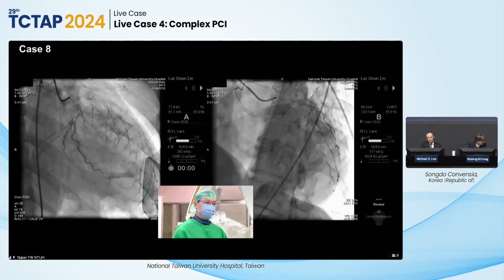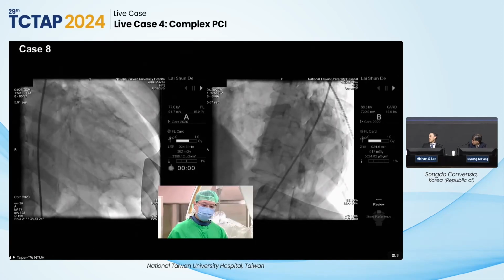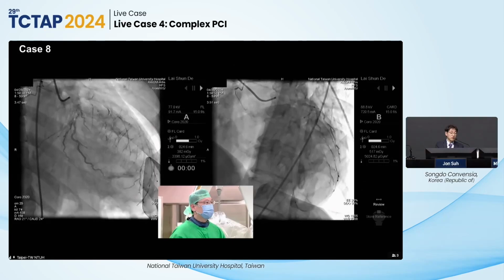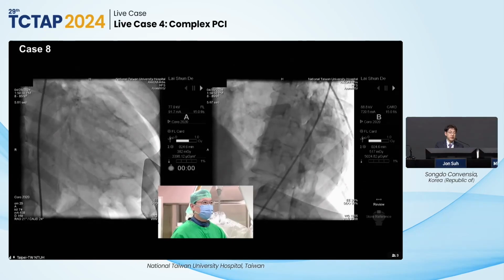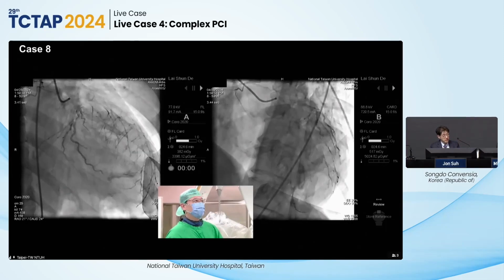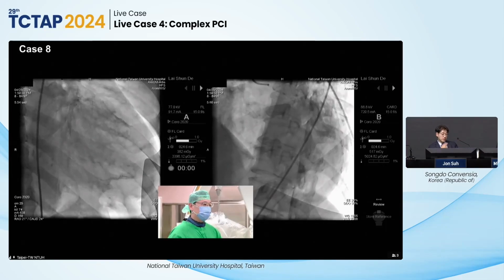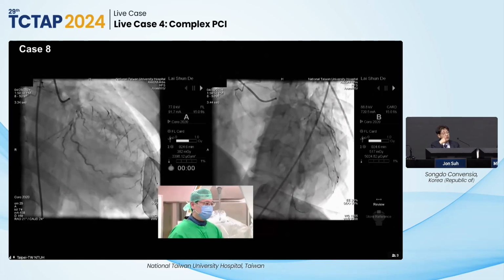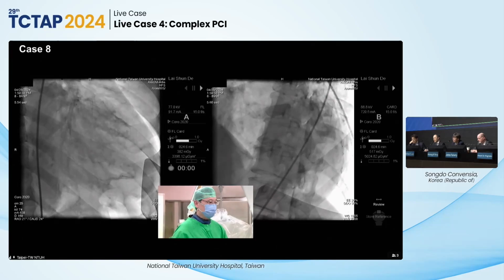And you said also left main bifurcation within a class 0,1,1, but I think left main ostial lesion is also very severe, so be careful about that. Yeah, it looks very small. It's probably a 1,1,1. Did you do a viability study to see if there's any recoverability, or you did not do any viability study?